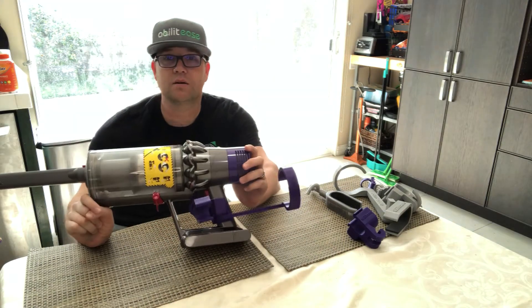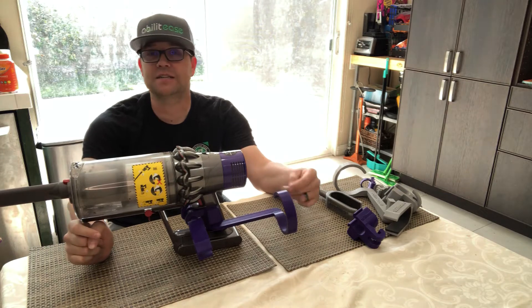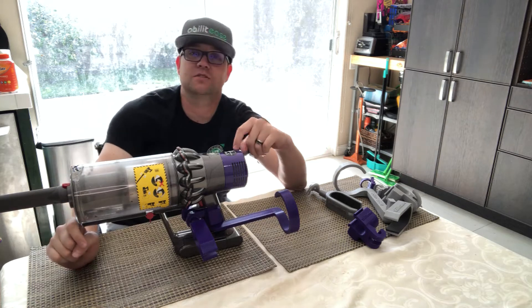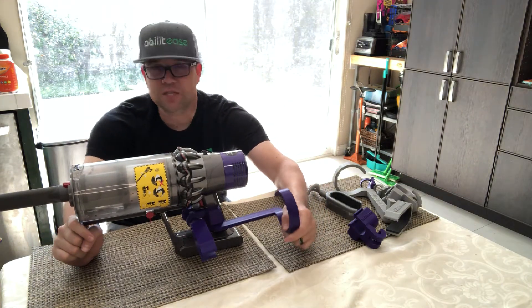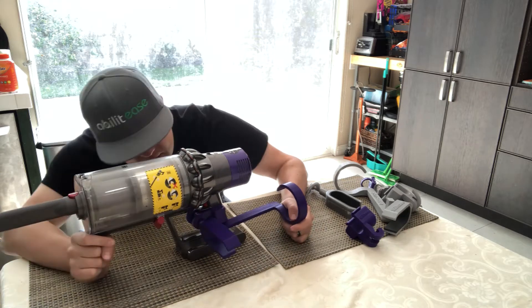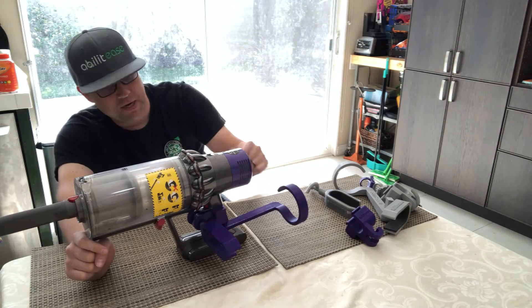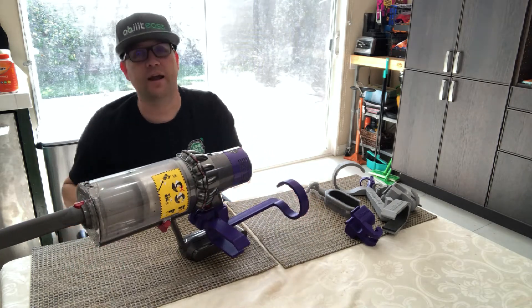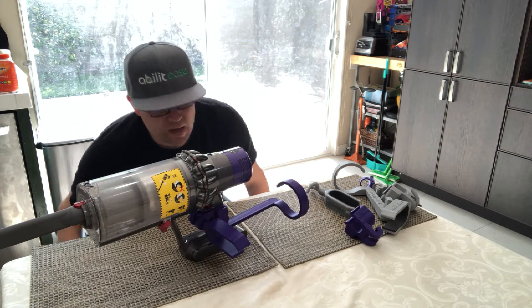Voila — we have our Dyson adaptive device that will allow us to engage the trigger. I tried to match it to the purple on the unit — very fancy. This was version 1, and with all these pieces working together it ended up working out pretty well. The idea here: handheld vacuum, using it in small spaces.